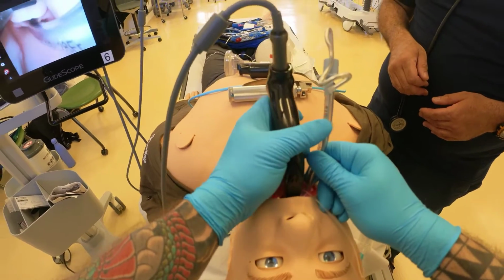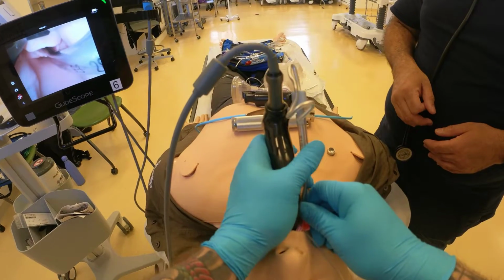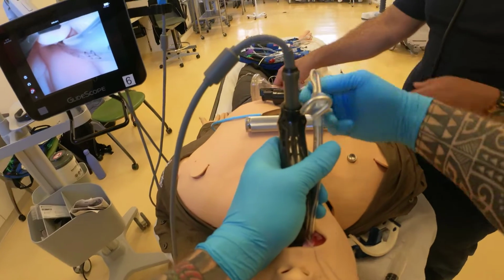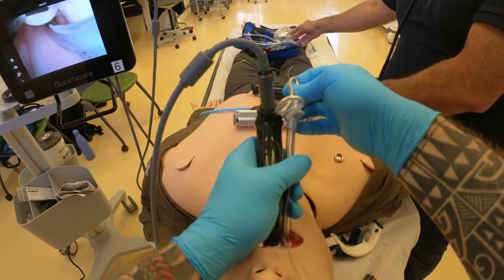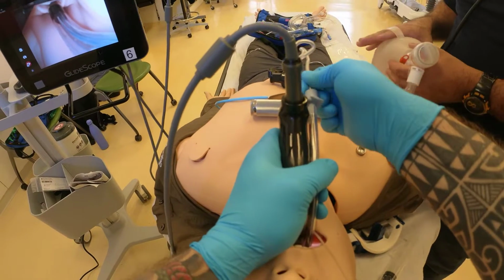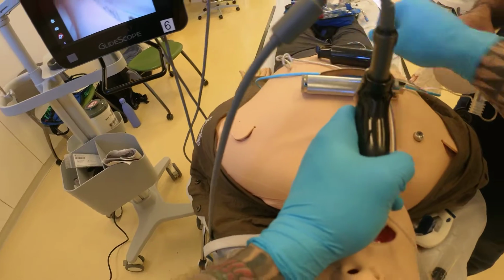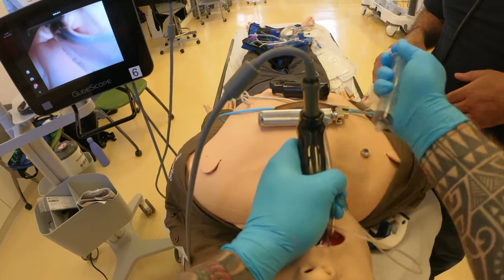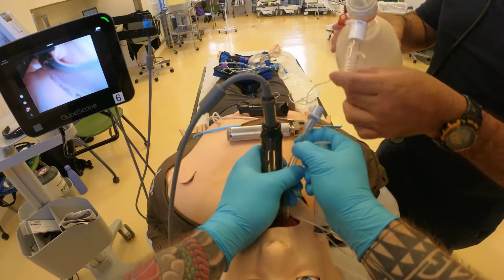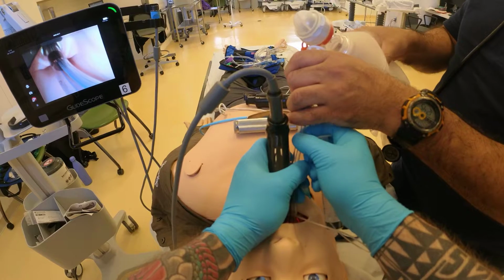And what I do is I hold this in place when I take out my stylet because I don't want to dislodge it inadvertently. So I hold this down and I'm going to remove this towards my feet. So what I'm doing is moving the stylet slowly towards the feet, making sure the tube doesn't get dislodged. So it's out. And then we inflate the cuff, and then my partner here is going to connect it and ventilate. So we see the tube is definitely in the right space.